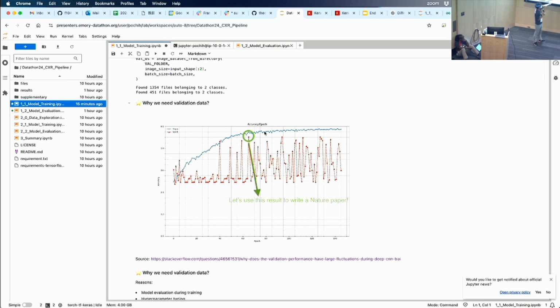And if we take the red one as our testing data, what will happen if we test our testing data several times? What kind of mistakes? So this is a fundamental question even from yesterday, right? So you have your training and test data. If you keep exposing your test data multiple times, what do you think is going to happen?